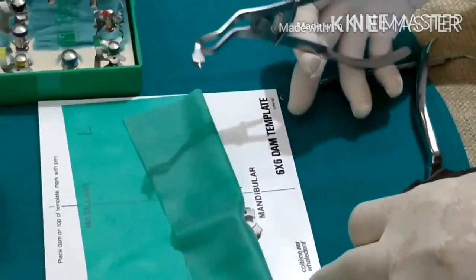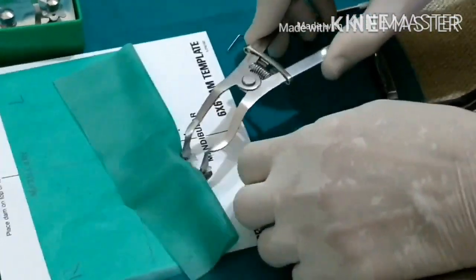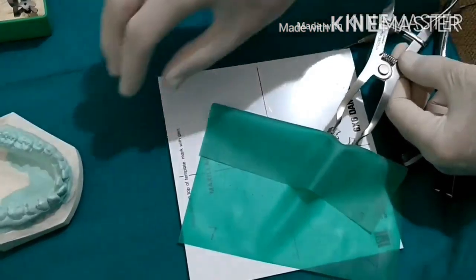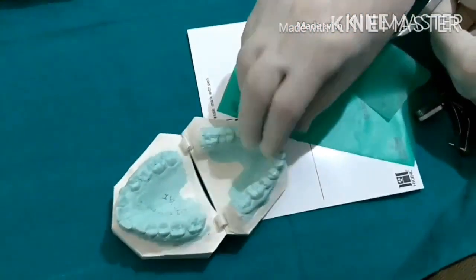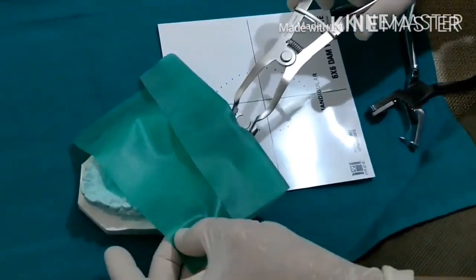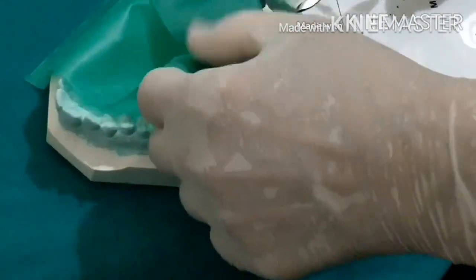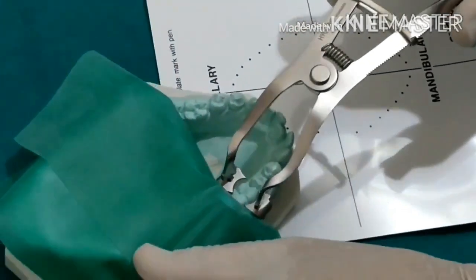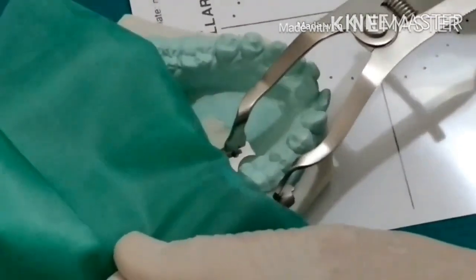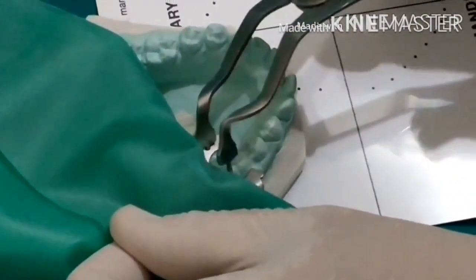Pick up the rubber dam forceps and put the beaks into the two holes of the flanges of the rubber dam clamp, expand a little, and lock it. Then go into the patient's mouth — on the model in this case. Remember: this is the right side, this is the left side, and the upper portion faces towards the nose. Go onto tooth 46, expand a little more so the patient has no pain, and while asking if it hurts, slowly release it onto the tooth. Then take off the forceps.